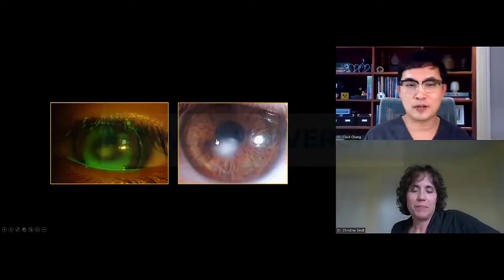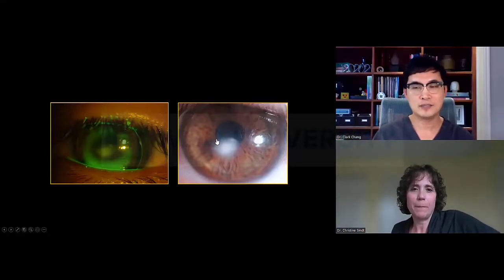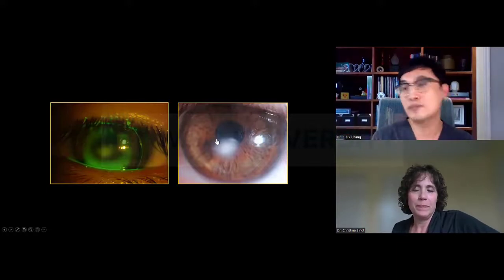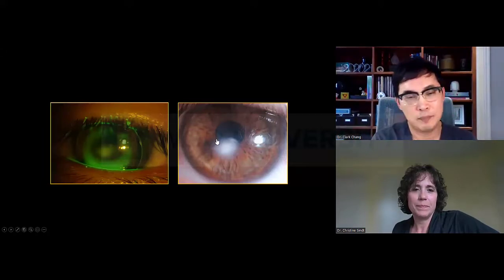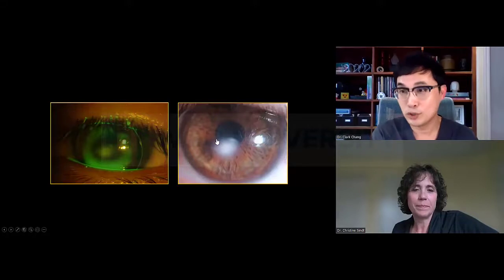We know from the CLEK study that 31% of patients associated with flat fitting corneal GP at baseline were observed at the end of a year study to have scar, versus only about 9% with steeper fitting corneal GP lenses at the baseline of the study. So possibly that association is something we shouldn't ignore.